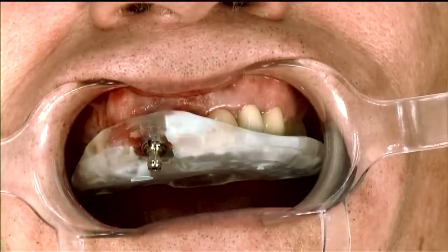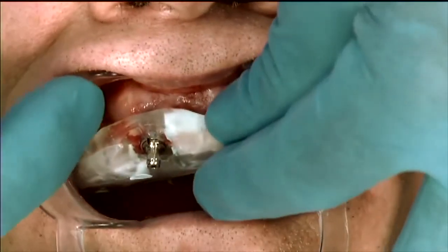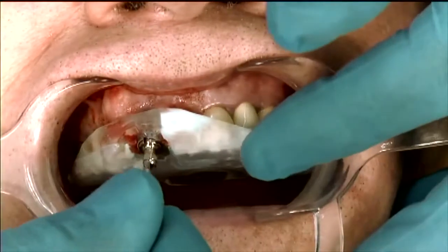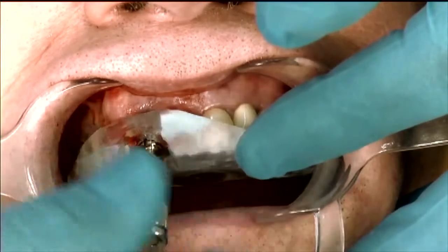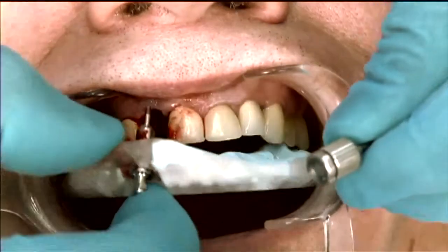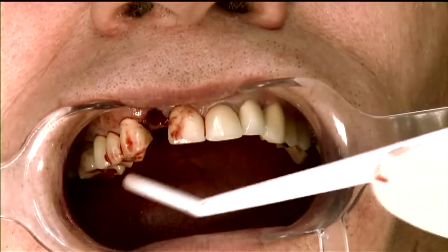Now what we're going to do is remove the mount and the guide. If I just move the guide out, I'm going to probably take the implant with it because the mount is connected to the guide, which is connected to the implant. So what we do now is we just remove the mount by unscrewing it, just like so, and then we gently remove that from the patient's mouth.